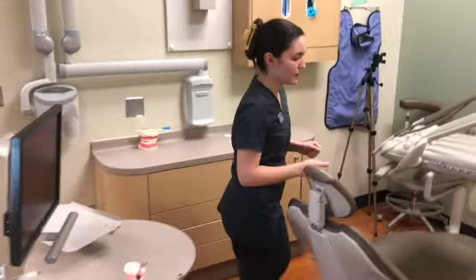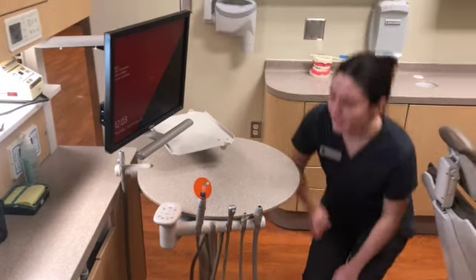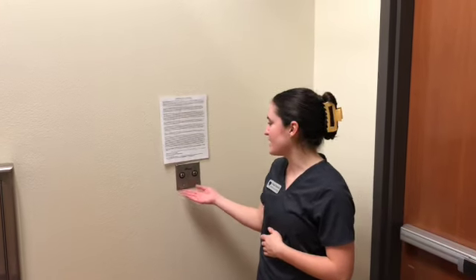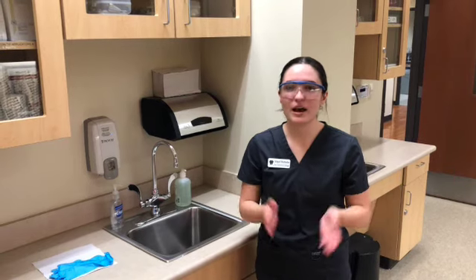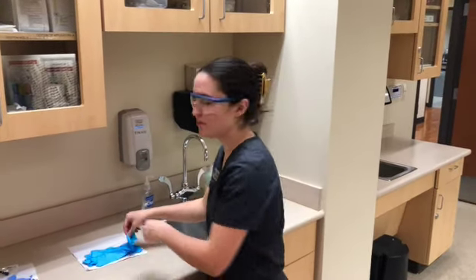And then I turn on the dental unit. And these are connected to the central water valve. And then the next step is to turn on the central air compressor and vacuum system. Alright, and the next step was to apply my glasses, and then I wash my hands for 2 consecutive 30-second hand washes. And now I will don my gloves.